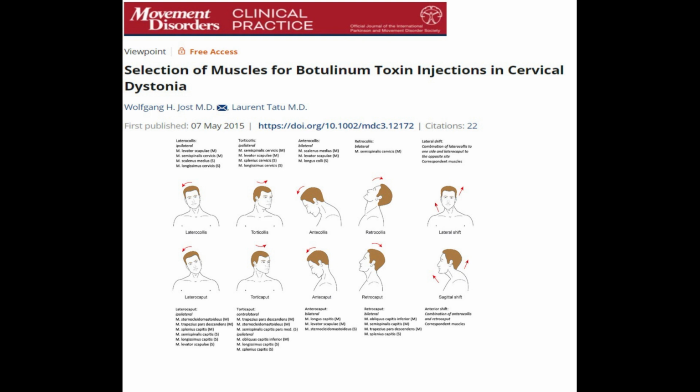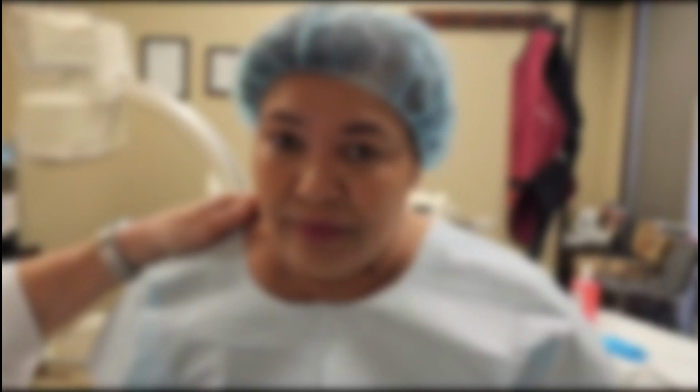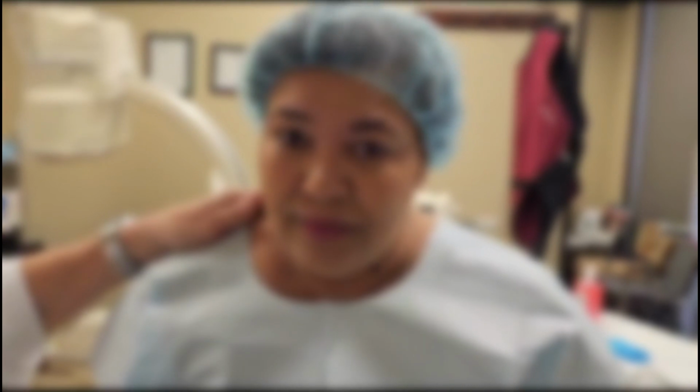The patient we're going to inject today has a cervical dystonia with a fine tremor, and she generously allows us to use her case for this teaching video. We can notice the fine tremor and also a slight tilt of the head to the left.